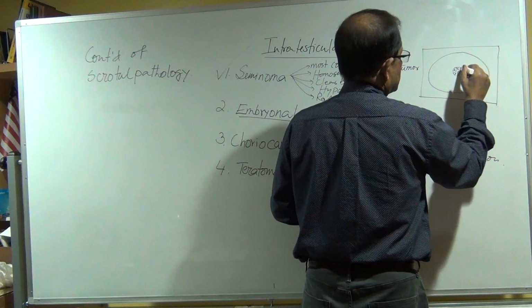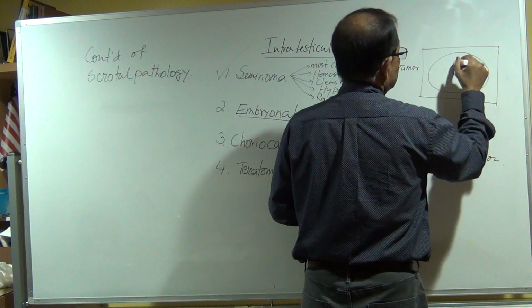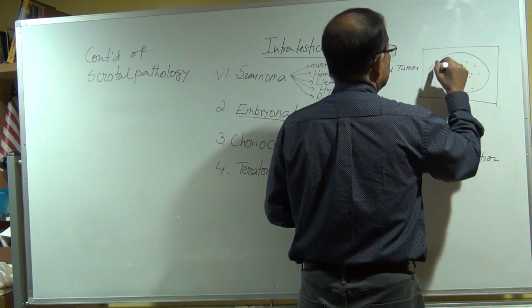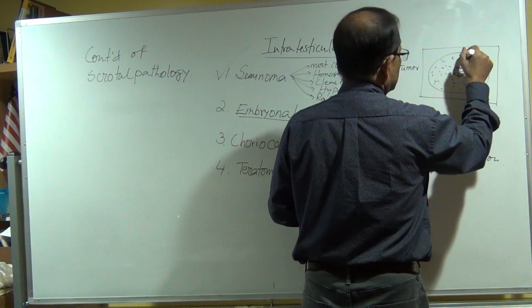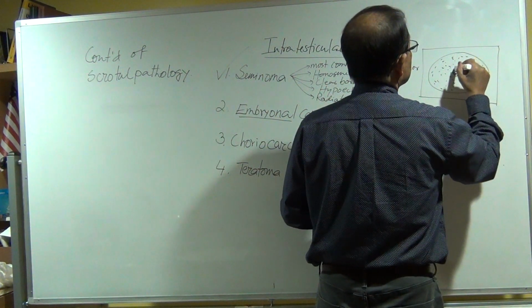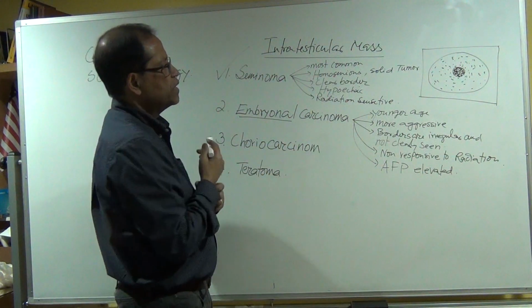So homogeneous, clear border you can see. This is seminoma, okay, hypoechoic.